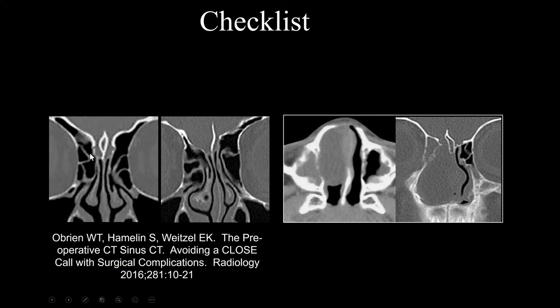Here is a normal example on the left, and on the right is a normal developmental variation involving the anterior skull base. In this particular case, it's just a normal variant with a little bit of the gyrus rectus extending inferiorly — notice how the cribriform plate is intact. However, you have to realize you can have other masses arising in the olfactory groove and sulcus that could give you this type of remodeling, so it forces you to look carefully in this area.